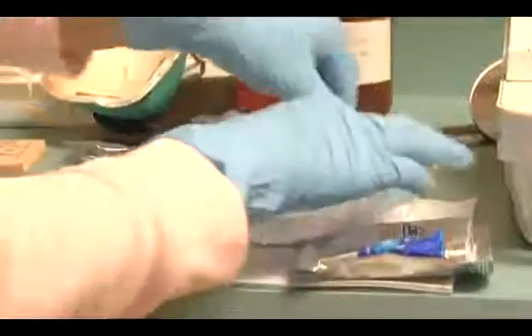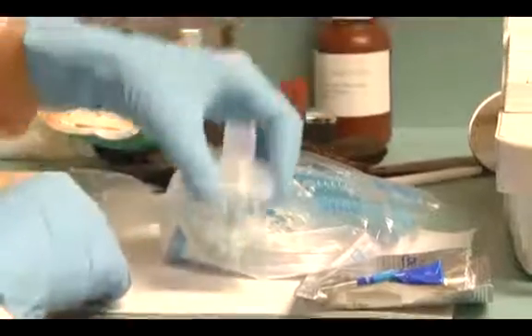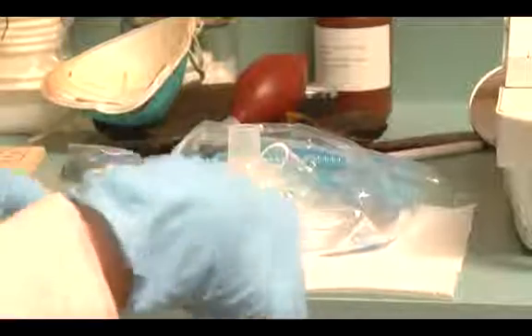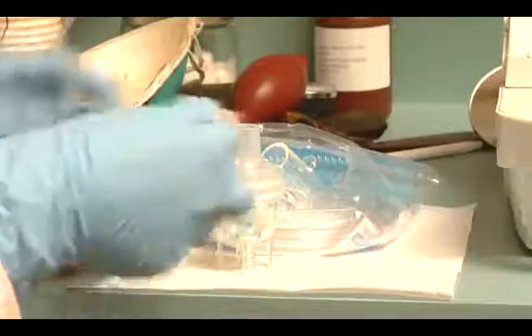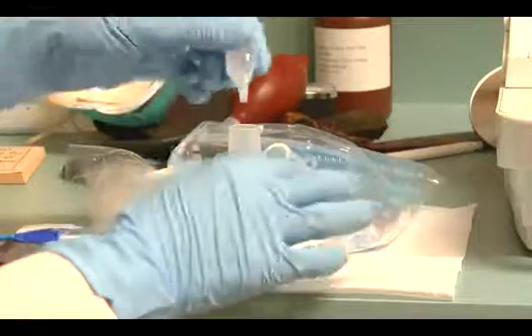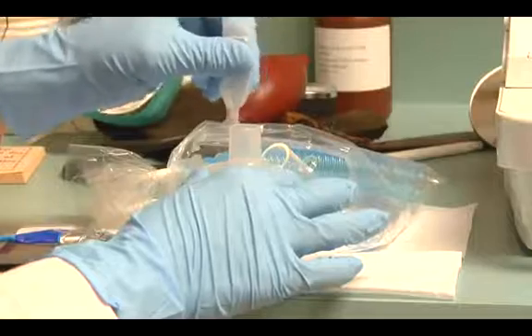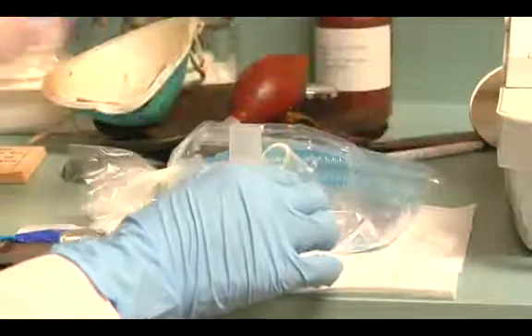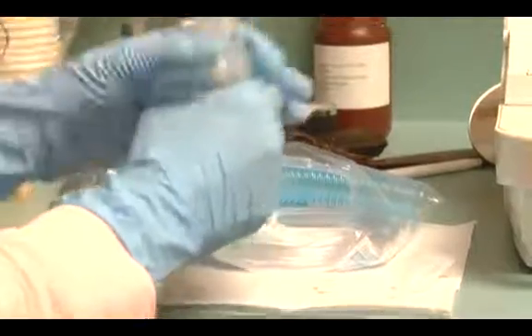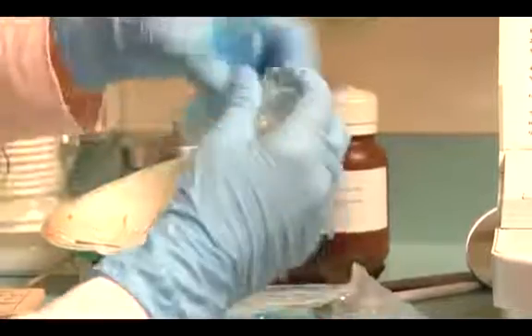And we're going to go ahead and take out the chamber. And we're going to take our medication and put it directly into the chamber. We're now assembling the T-piece, and we're going to assemble the mouthpiece.